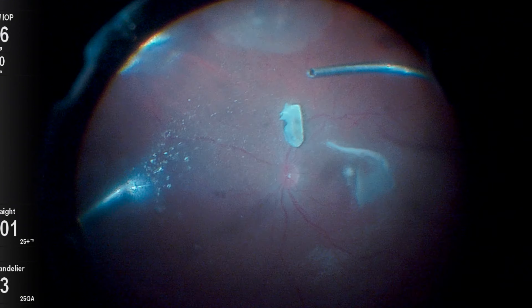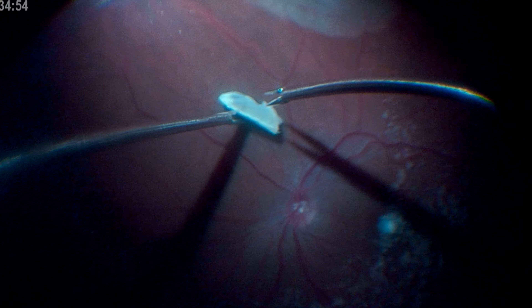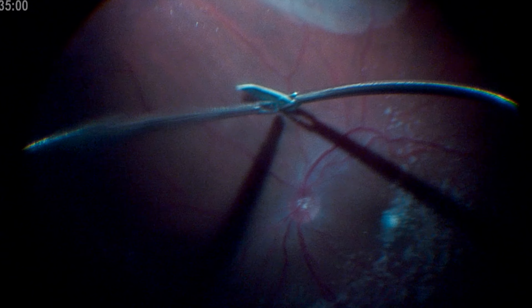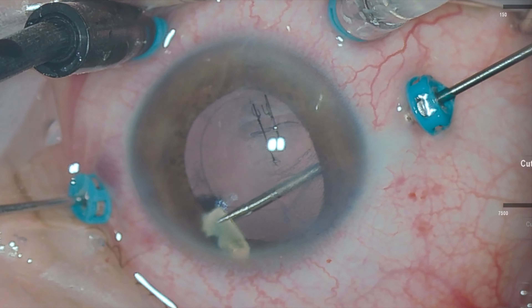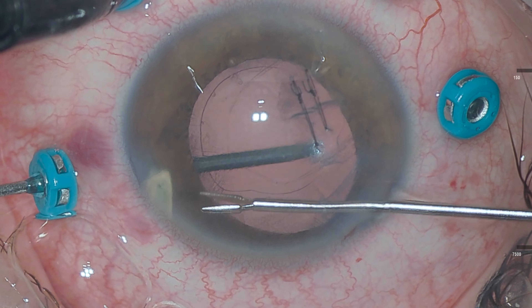As it is a beveled metallic foreign body, we use two retina forceps to handle it very carefully to avoid any iatrogenic injury to the retina. One forceps serves as support while the serrated forceps grasp the foreign body firmly. Subsequently, the intraocular foreign body is positioned over the iris and extracted from the eye through the main corneal incision.